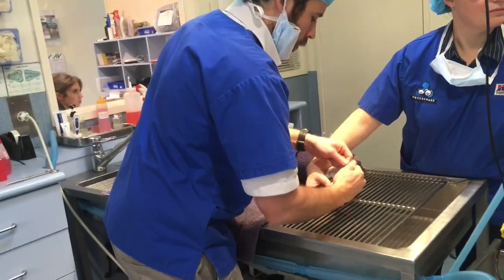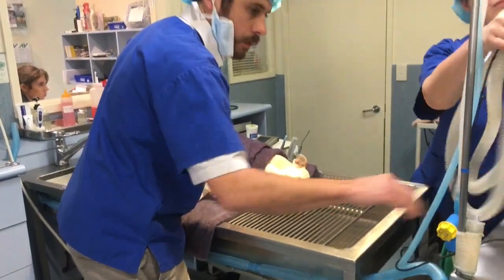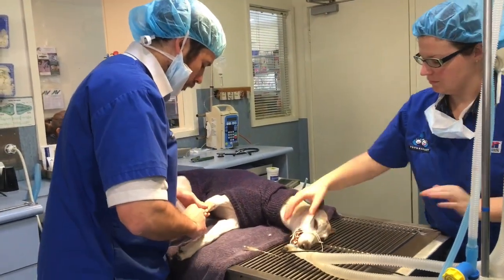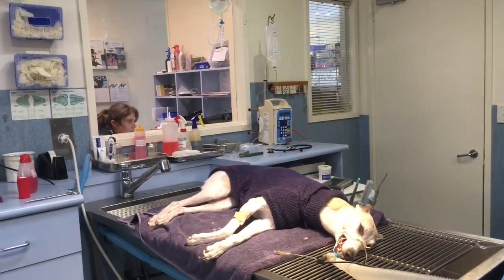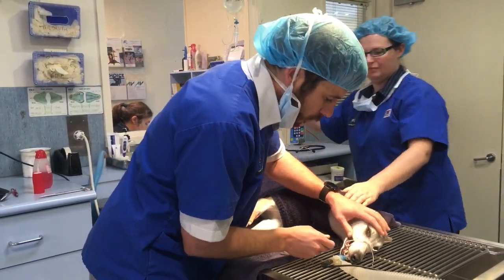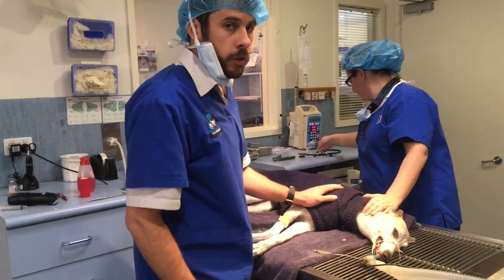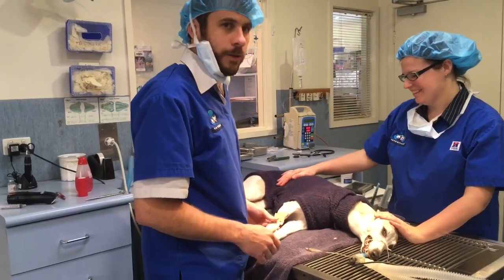If we weren't giving Rosie the anaesthetic gas she'd wake up pretty quickly, because this Alfaxan induction agent works very fast. Sometimes we use it just for IV sedation — if we're going to do something quick like pulling out a grass seed or taking off a broken nail. We pass the tube down into the throat, down into the larynx, and tie it in. This is just a reaction of her body from having something down in her airway. Pop her on the other side of gas, pop the cuff up — and that's how we anaesthetize the dog.